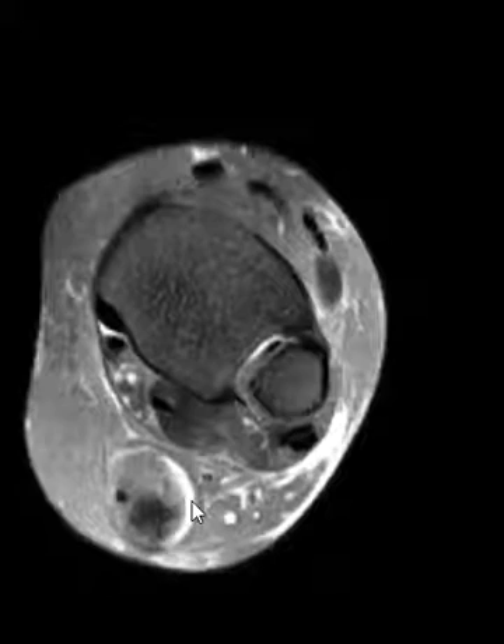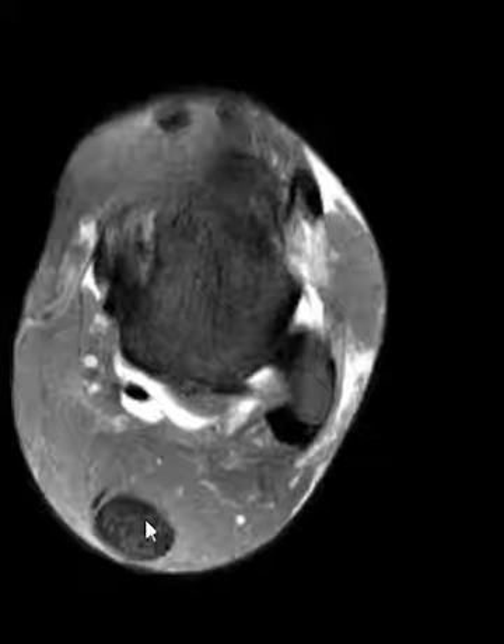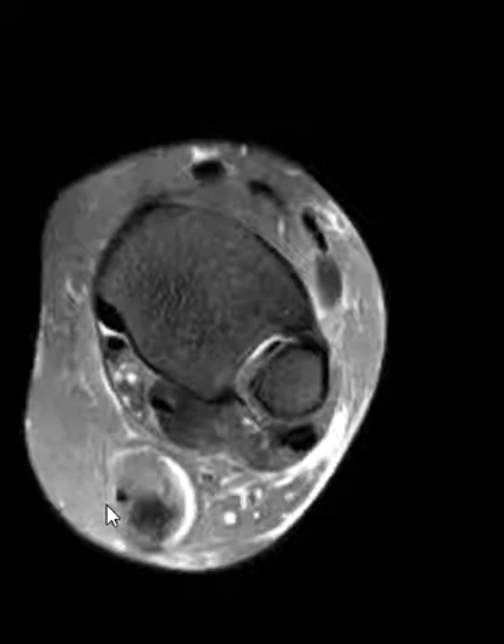The only thing holding on here is this little black tube, and this is the plantaris tendon that's going to come down medially and attaches right over here on the medial margin of the calcaneus. So this is the plantaris tendon, not to be confused with a little fragment of the Achilles tendon that's holding on. Thank you very much.